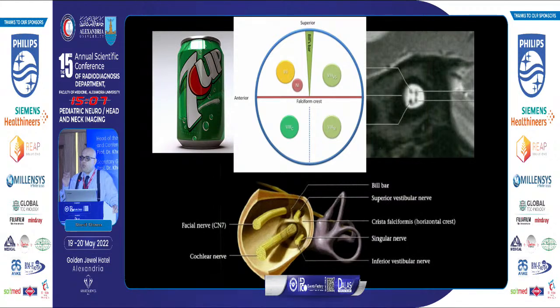Please note that the cochlear nerve should be at least the same size as the facial nerve. If the cochlear nerve is smaller than the facial nerve, this is the definition of cochlear nerve hypoplasia. Note here the fine meningeal adhesion between the superior and inferior vestibular nerves and the cochlear nerve.